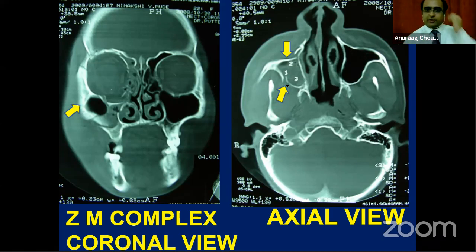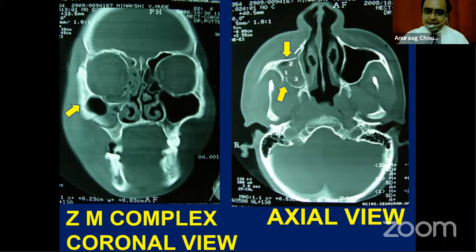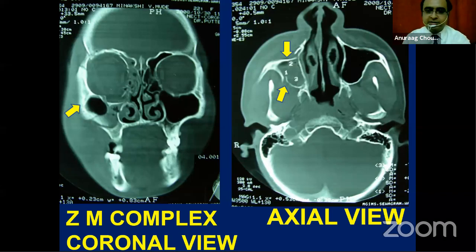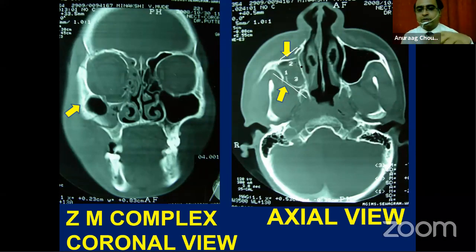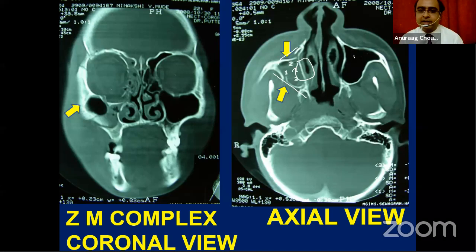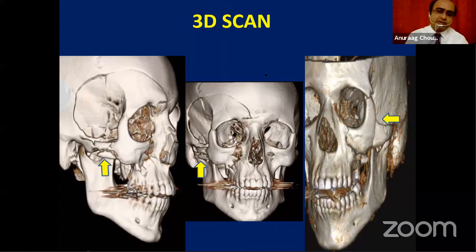In the ZMC complex fracture, you can see the discontinuity of the anterior lateral wall of the sinus, posterior lateral wall of the sinus, and in panfacial trauma, discontinuity in the medial wall of the sinus as well. Comparing both sinuses, you can evaluate the fracture lines in the axial plane and coronal section.